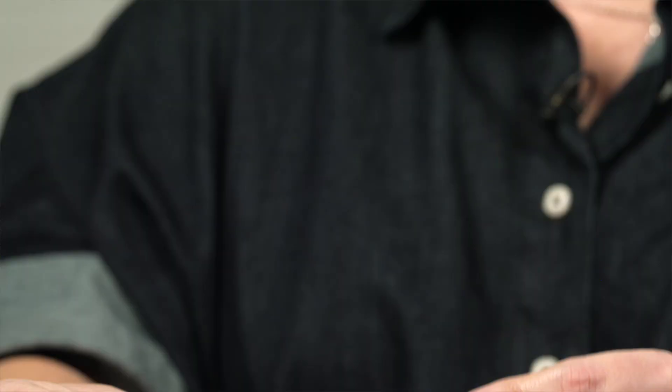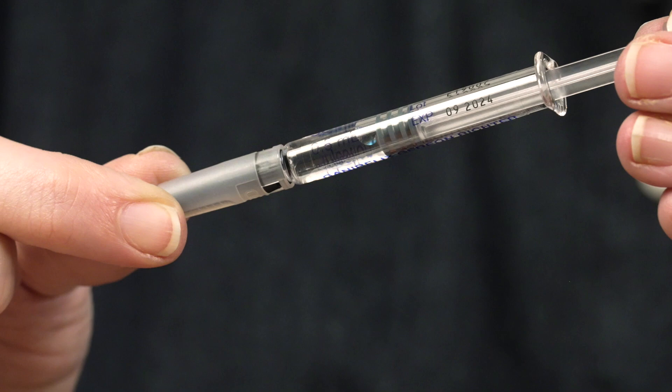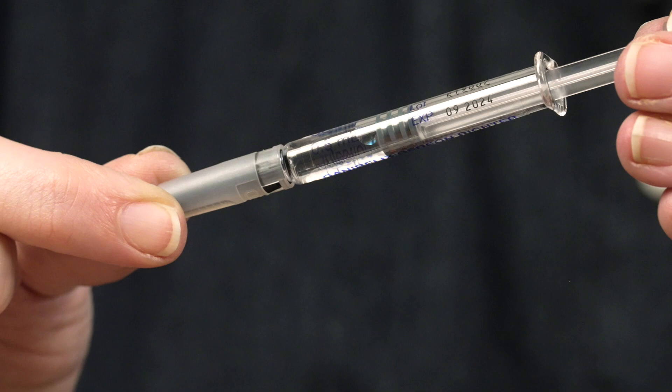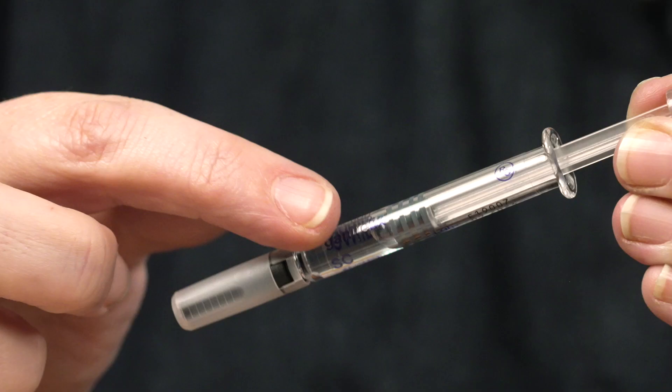Is there anything else I should know? Yes, there are a few things that you need to check before you use your injection: ensuring the syringe is not cracked or damaged, check the needle cap or shield is tightly attached and that there is no fluid leakage, and that the solution looks normal — which means that there are no particles in it and it's colourless.